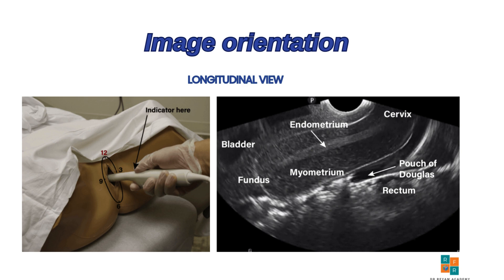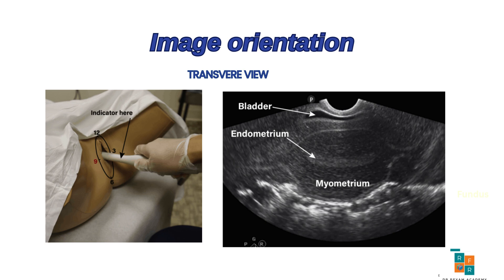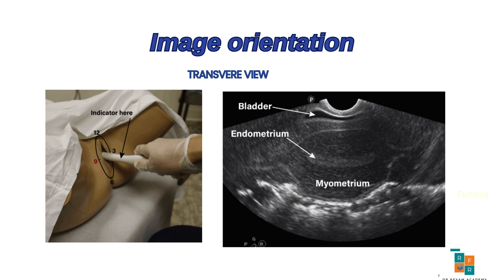Next, let's rotate the probe to obtain the transverse view. The transverse view of the uterus is obtained by rotating the transducer 90 degrees counterclockwise from the longitudinal plane, positioning the indicator towards the patient's right side, corresponding to the 9 o'clock position.